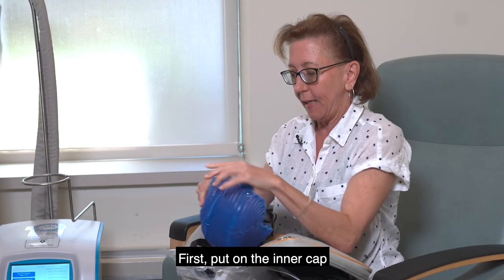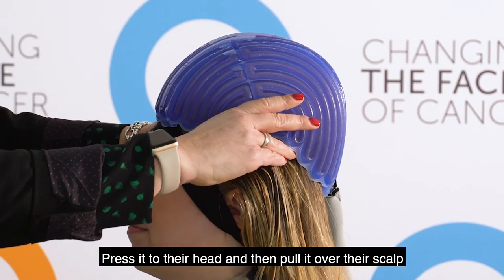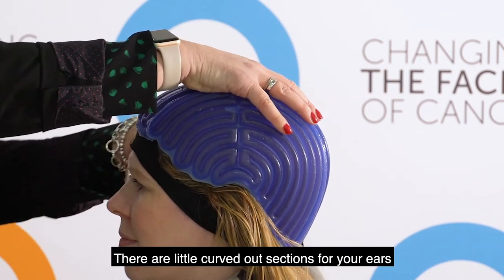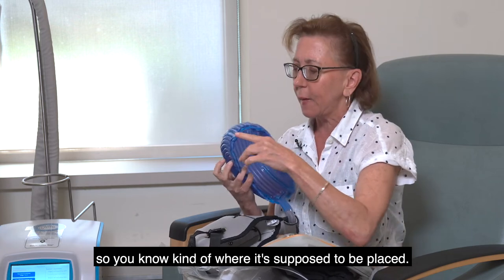First put on the inner cap, press it to your head, then pull it over your scalp and fit it. There are little curved-out sections for your ears so you know where it's supposed to be placed.